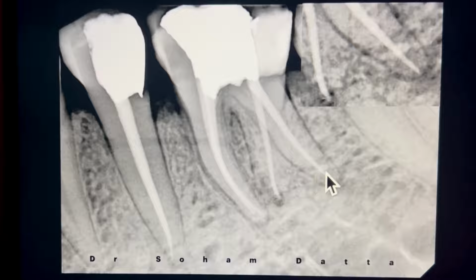Now if you see, this is the distobuccal canal. In the apical third, there is some amount of sealer spread through the accessory canals. Here is the magnified image. You can appreciate that some amount of sealer spread to the accessory canals. Here also and here also. On the distolingual root also. So this is the distolingual GP, distobuccal GP, mesiolingual and mesiobuccal GP.